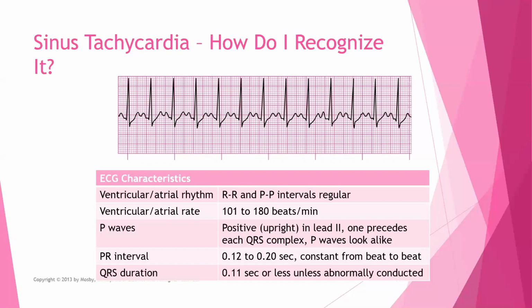So from where that is, that R, to the next heavy line, 300, 150, 100. Okay, this is between 100, which is less than it, and 150 that is more. Now, would I just say it's between 100 and 150? Not really, because there's a huge difference between somebody having a heart rate of 102 and someone having a heart rate of 147. So how would I know?